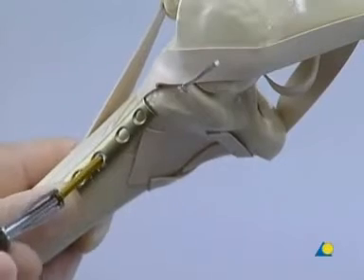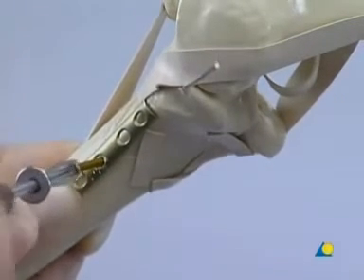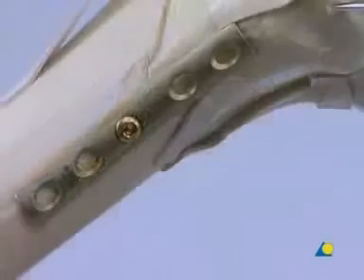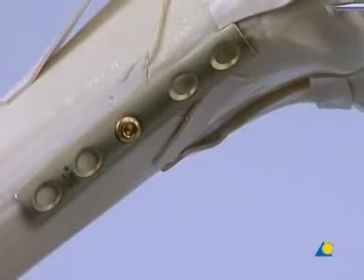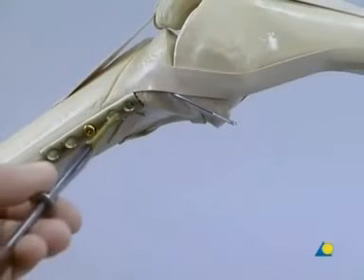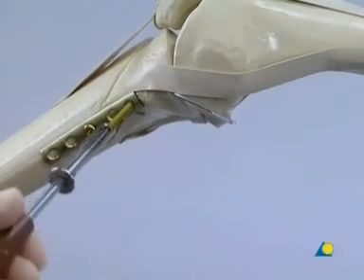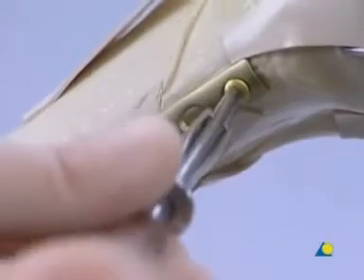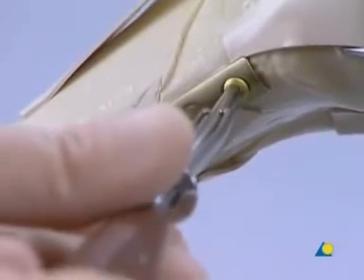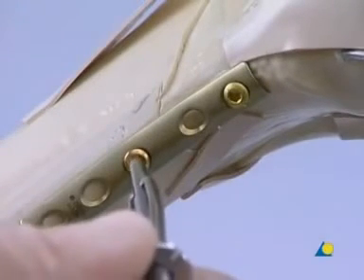A Cortex screw is inserted through the middle hole of the plate. This maneuver pulls the plate into its anti-glide or buttress position, thereby reducing the fracture indirectly. Next, a Cortex screw is introduced through the most proximal plate hole. After placing the most proximal screw, the first screw will need to be retightened.